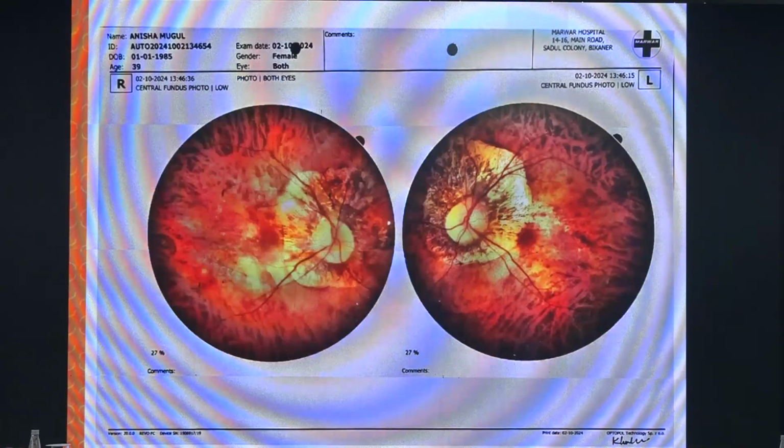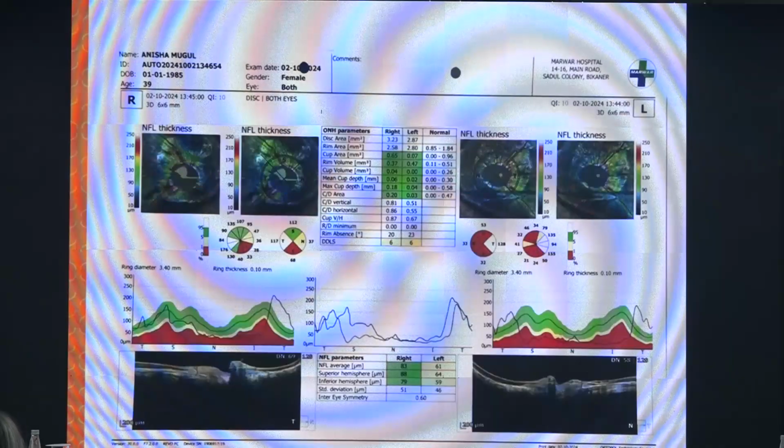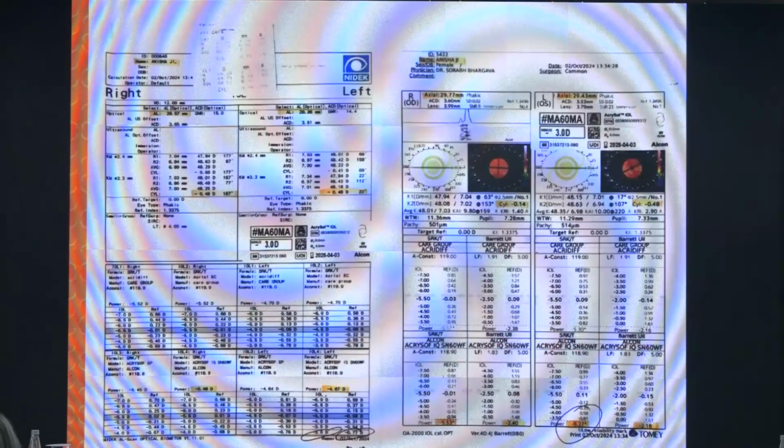Here, this is the fundus photo showing a lot of changes, as we all know, that are common with myopics. A B scan should also be done so that you might discover a staphyloma which was missed otherwise. OCT, as I just said, is important. The RNFL also is bizarre in myopics. It doesn't follow the characteristic hump pattern because of the thinning of the RNFL. But it's stable, so it can be differentiated from glaucoma.